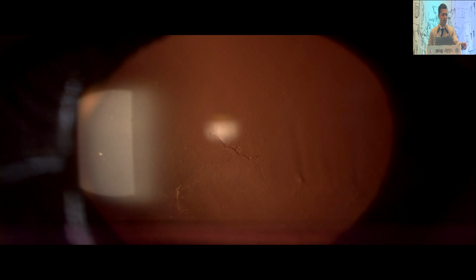So if I had done an anterior segment OCT and evaluated not for pachy or epithelial mapping but sheer anterior segment OCT and seen the thickened membranes, or done a retroillumination photograph, maybe I would have been wary of doing LASIK. To end my talk, it's not only pre-op but also post-op.